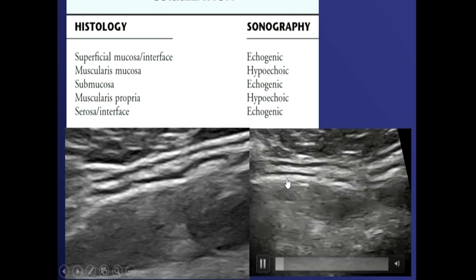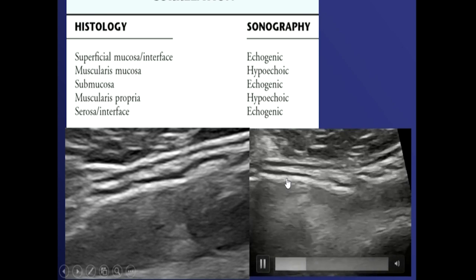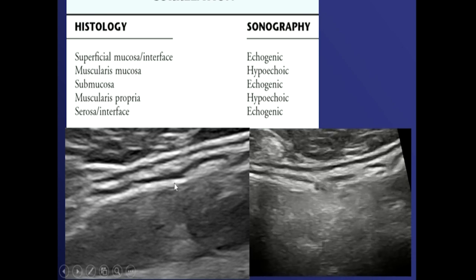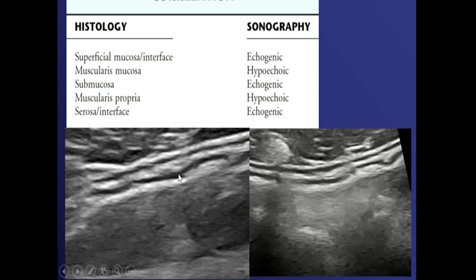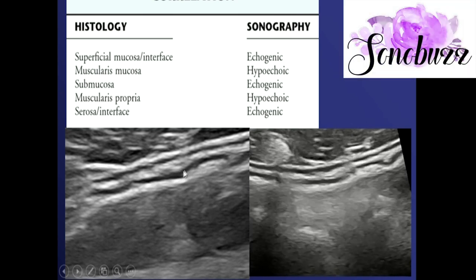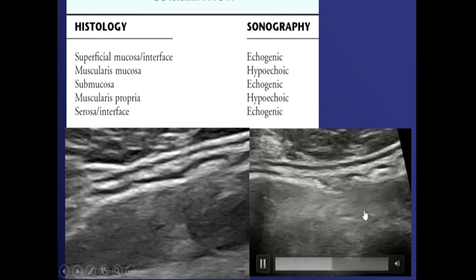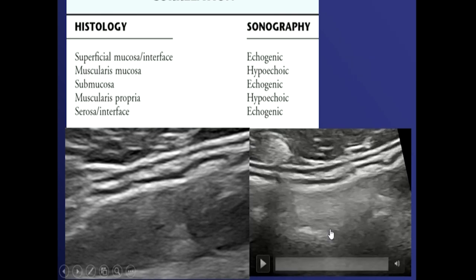The typical gut signature: there are five bowel layers. The superficial mucosa interface is echogenic, then muscularis mucosa which is hypoechoic, then submucosa, then muscularis propria, and finally the serosal interface which is again an echogenic line. This is the typical bowel signature — this shows fluid within the stomach giving better contrast.